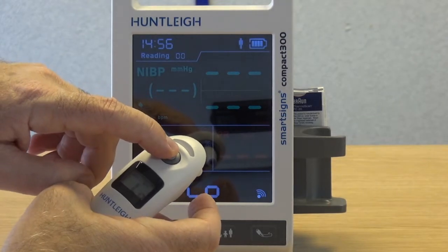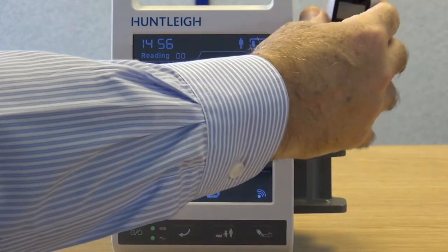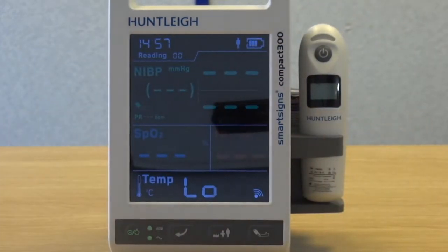Switch the sensor off and place it into the holder. Pairing only needs to be carried out once. Please note, only one sensor can be paired with one host.